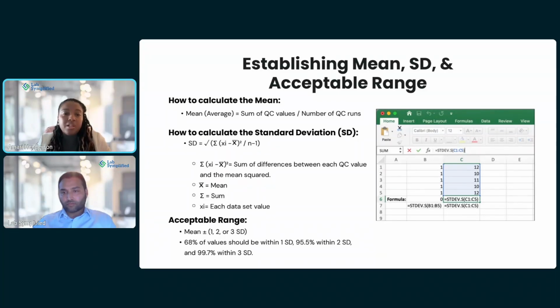I know a lot of times if you could not get the QC in within your shift, that's when you have to start, because I was a team lead during the weekend sometimes, trying to figure out, are we going to have to start sending samples to another facility, our reference lab? You kind of want to get some guidance from someone who's more experienced than you.